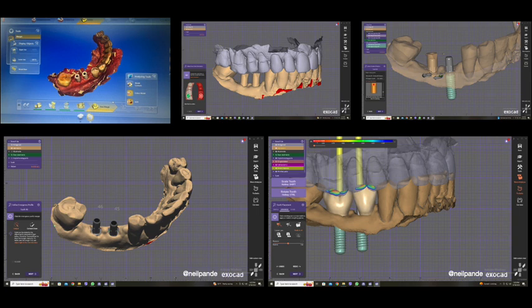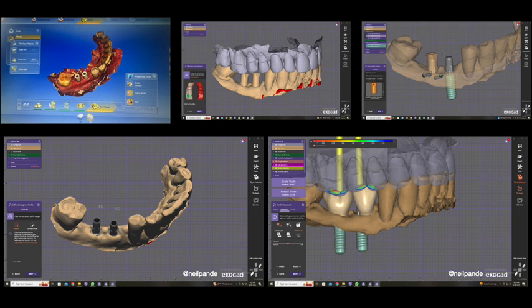You can use any abutment you want. The problem with CEREC when using Omnicam is that the scan post does not allow any other abutment except Variobase for CEREC. Whereas with this workflow, you can actually choose any abutment you want.